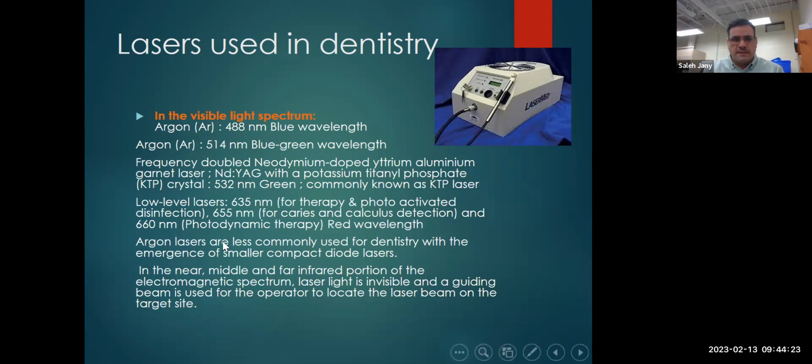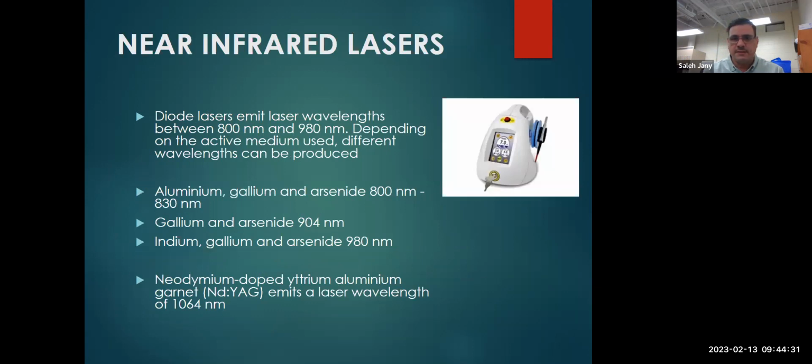And some active lasers are cutting. Some lasers are used for physiotherapy. I have a picture. This is that laser. It's one of the cheapest, about $3,000. And it's used for gingivectomy, frenectomy. When you do a crown and bridge, you cut the gum around the tooth. You can use this.